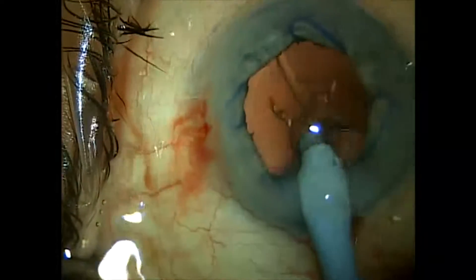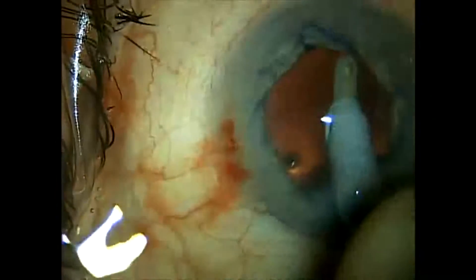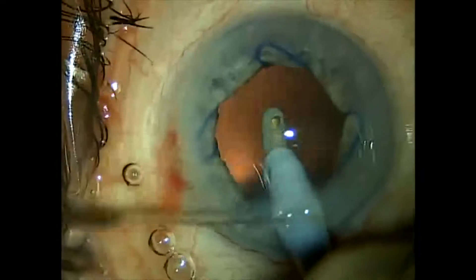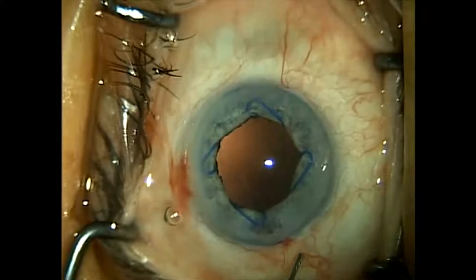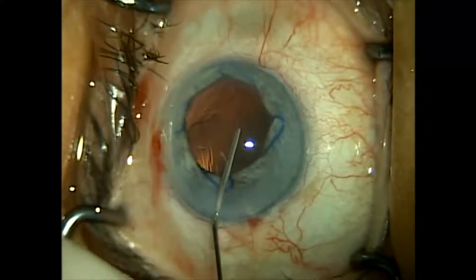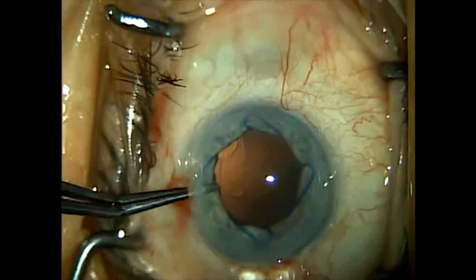I like the silicone tip because it is very capsule-friendly and has helped reduce our rate of posterior capsule events. We're able to polish the posterior capsule just by massaging it with the silicone tip. There's our iris wanting to pop out of the phaco incision — no big deal. We manage it by placing some more viscoelastic into the capsular bag in preparation for inserting our Bausch & Lomb LI-61AO monofocal lens implant with aspheric optics.